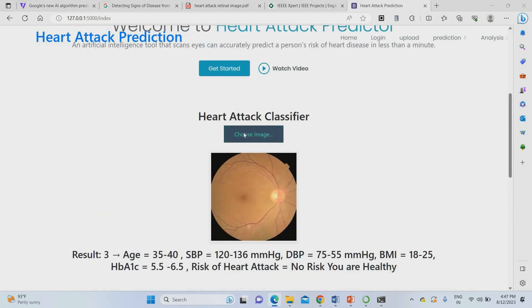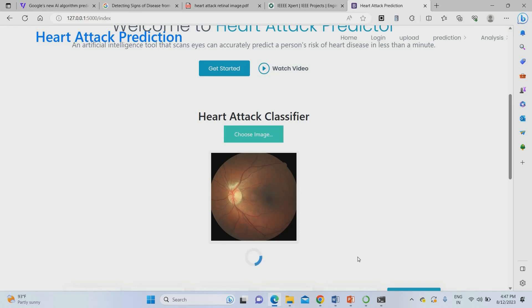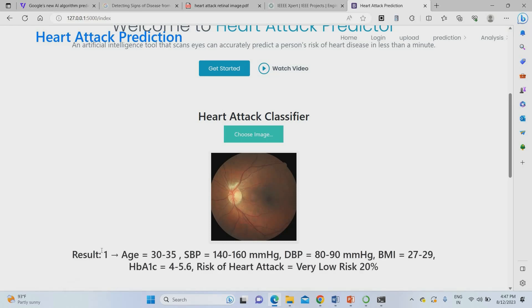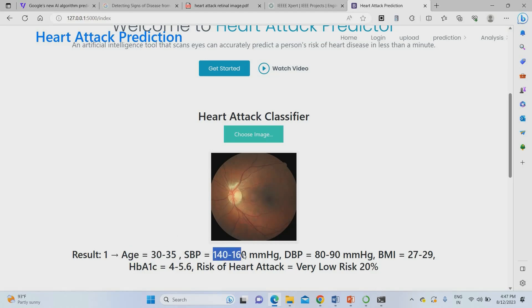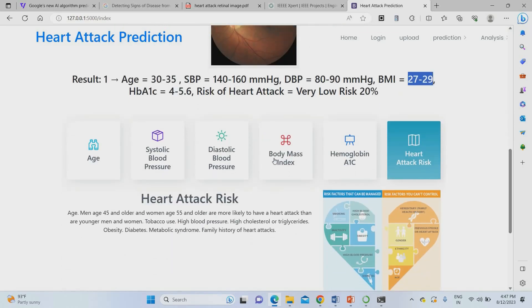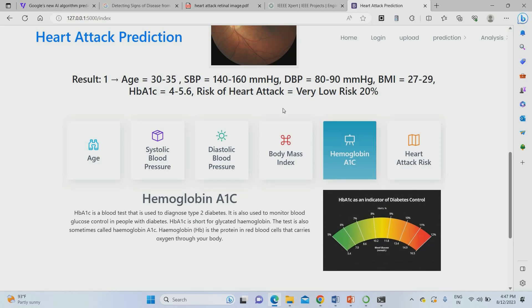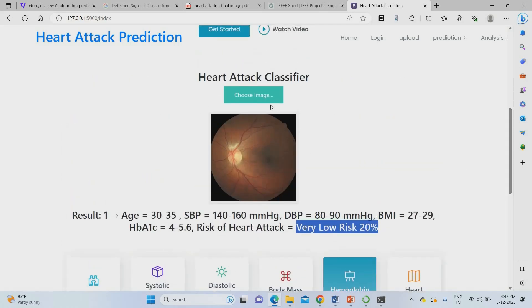We can check another image. Just go to choose images and select a different image to check. The result: age was 30 to 35. Systolic blood pressure was 140 to 160 for that retinal image. Diastolic blood pressure was 80 to 90. BMI was 27 to 29 — meaning overweight. HbA1c ratio was 4 to 5.6, which is in between range. Overall risk factor was 20% — this person has a 20% chance of heart attack.